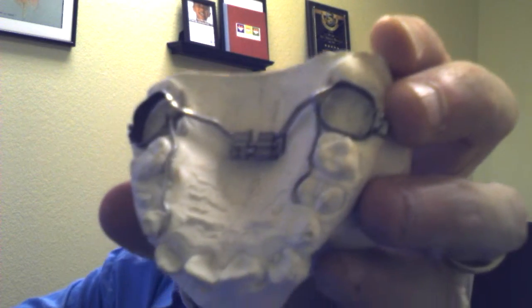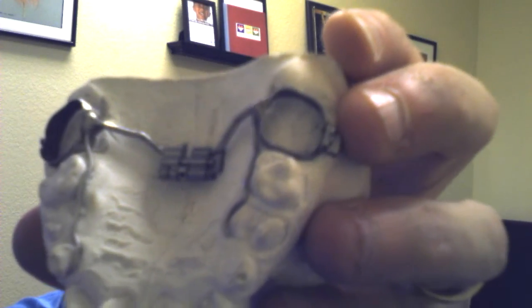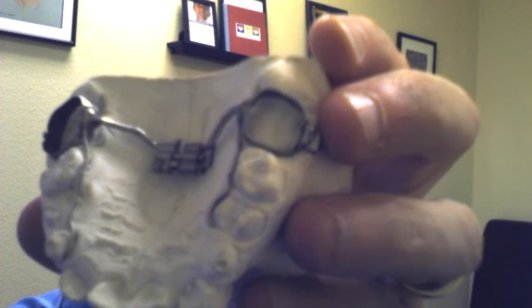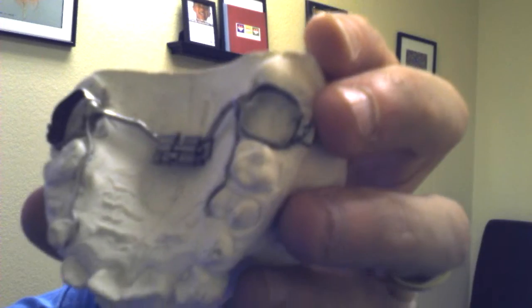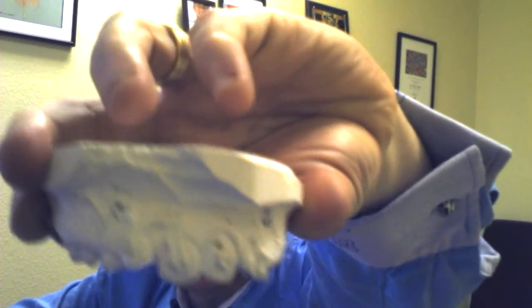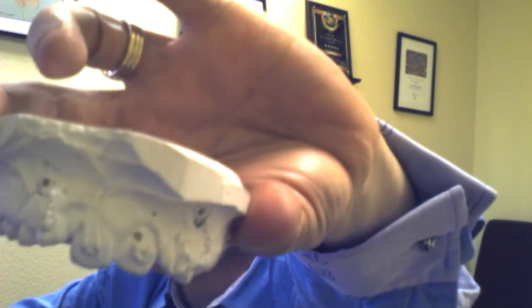Let's begin with what they look like. Typically, most of our expanders would look something like this, where there are rings around the back teeth and a little screw that sits at the top of the mouth. So this would sit like that inside the top of your mouth.